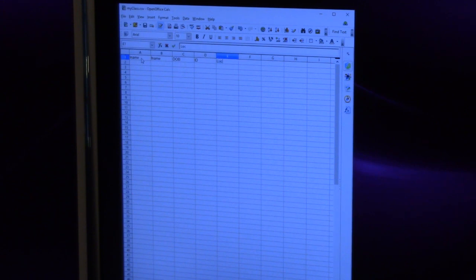Then the location, which is a column again that we don't use, so we will make up data for that. And contact. You might wish to put in a generic local Lions Club email address. If the school nurse wants to put the school nurse's address in there, that's probably more appropriate for the school setting. Today we're just going to put something in there.